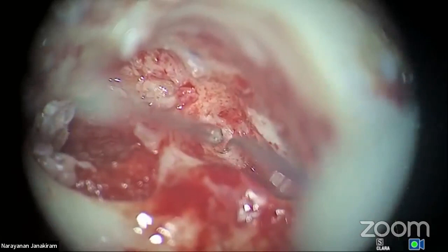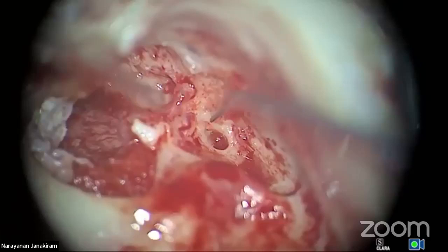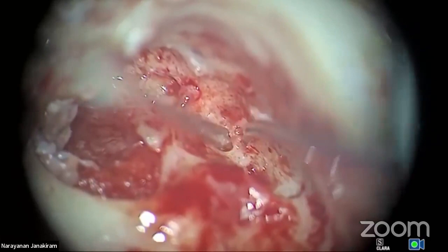A small cell only. Can you see that? Small cell. Yeah, so that's not the facial now. The facial is slightly behind it, anterior to it, I mean. Okay, now I think I've done full justice to the perilabyrinthine cell block.